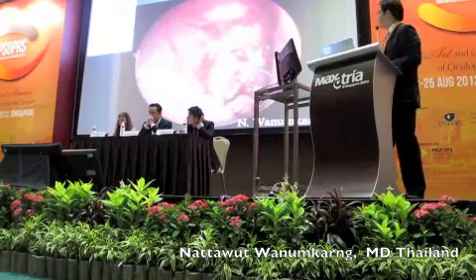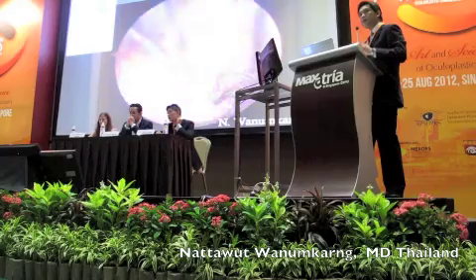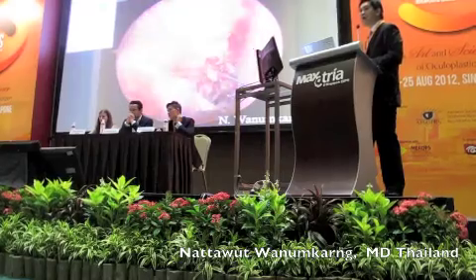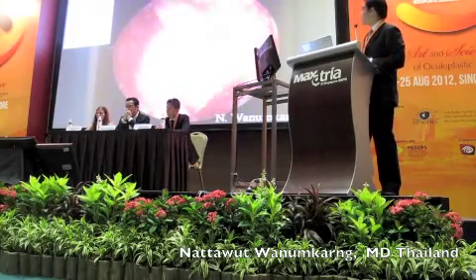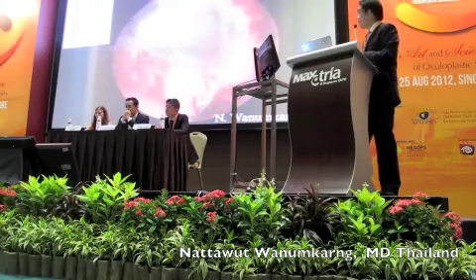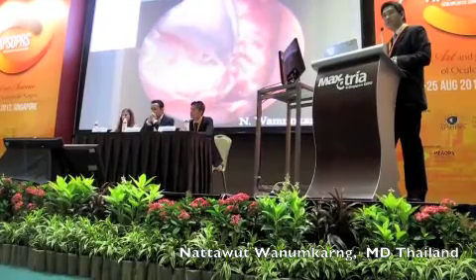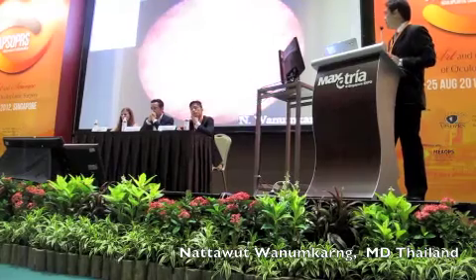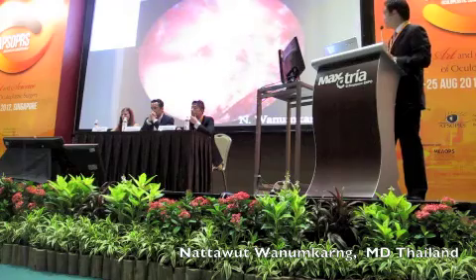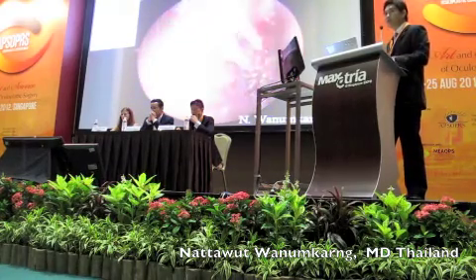So I decided to suture the anterior flap with 6-0 Vicryl, and then bend the needle from 135 degrees to 180 degrees, because the needle at 180 degrees can work really well in a small cavity. Then suture the upper suture — one suture may not be enough. I personally suture in every case, with two sutures for the anterior flap. The benefit of the sutured flap is to get primary intention healing, promote healing, cover the bare bone, prevent bleeding, and promote patient comfort after surgery. After this, we may suture the posterior flap if we have time and enough mucosa. Then I inject triamcinolone at the flap, put Gelfoam for hemostasis, and put the silicone stent on.